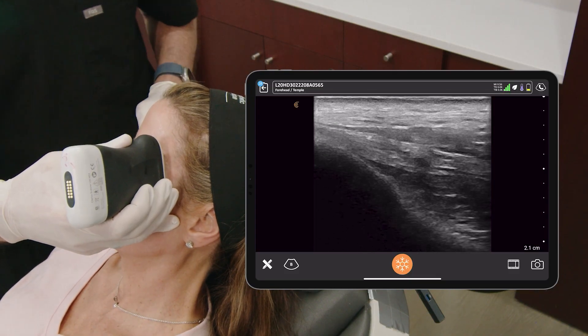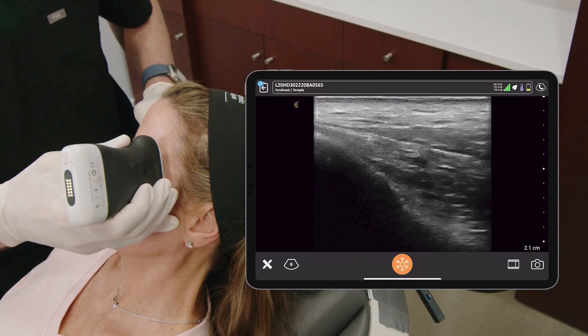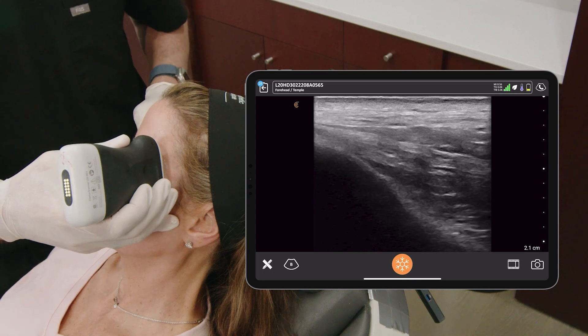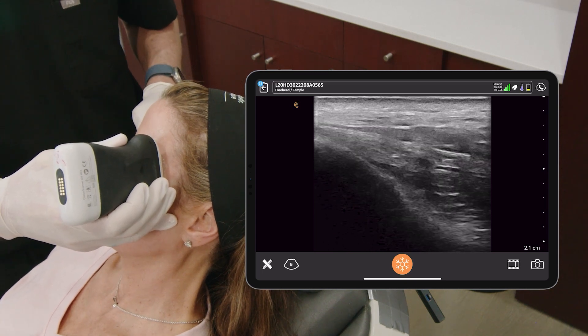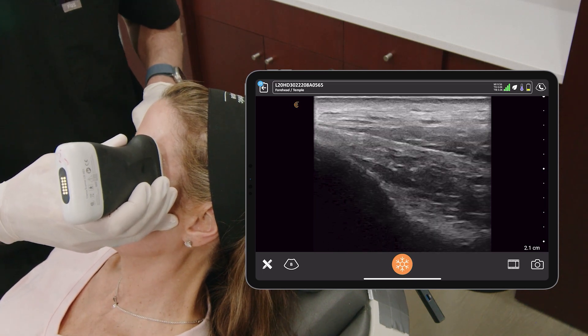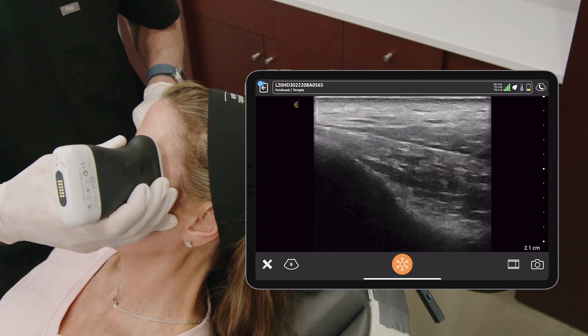Remember when you hold the ultrasound, make sure that part of your hand is actually touching the patient. It allows you to make fine movements.